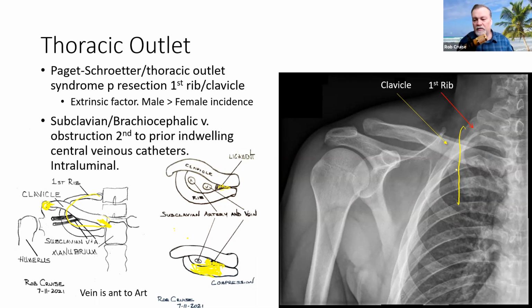Say, for example, you have your brachiocephalic or your superior vena cava coming down, right? There's no real bony structure right next to it. So if you have a plaque buildup in it or excess growth, you go in with your guide wire, deploy your stent, it reopens, and there's no big deal.